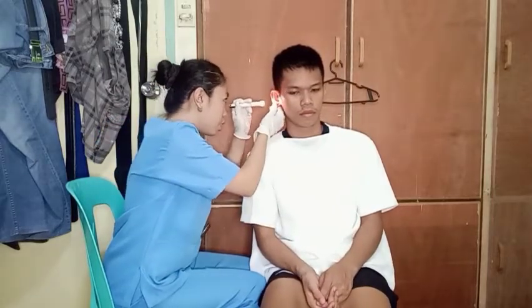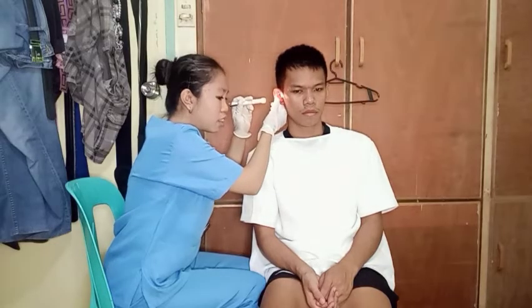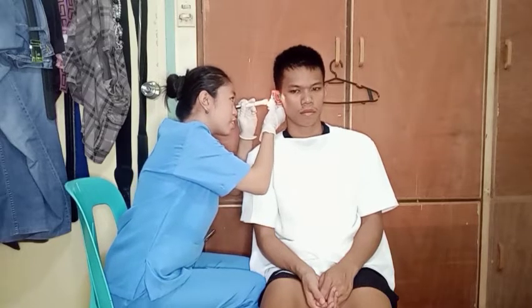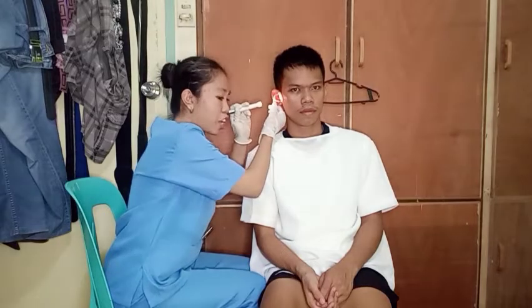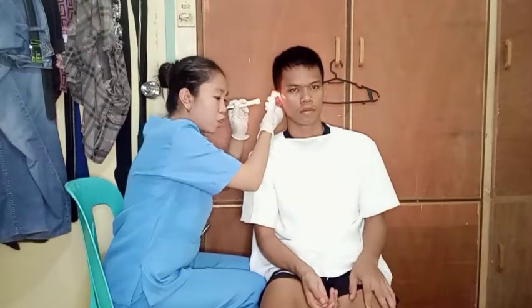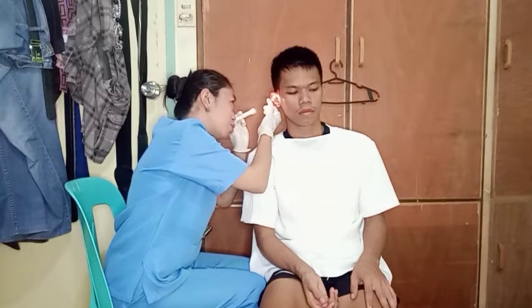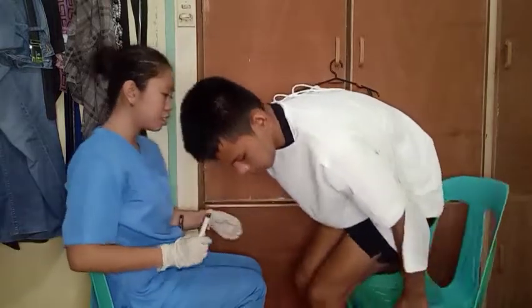Okay. So, for the ear canal, I can see the presence of hairs. There is no discoloration and the color is evenly distributed. There is also no strange discharge coming out from the canal. And you can also see, sir, the consistency of the cerumen, the color, as well as the canal wall. There is the presence of cerumen. Okay, thank you, sir. This means that they are all good signs. Onto the other side, sir, please.